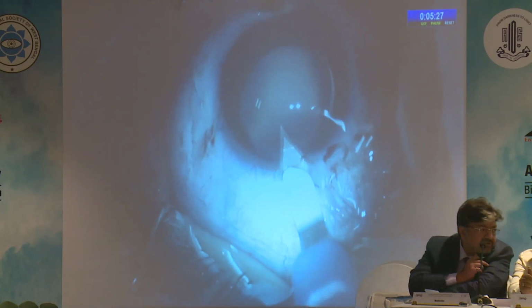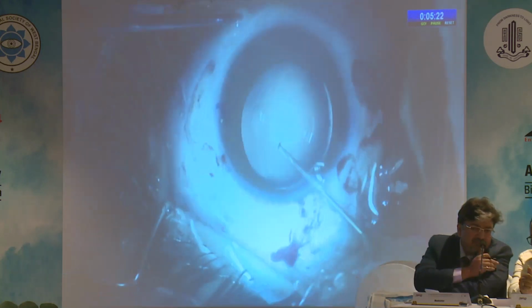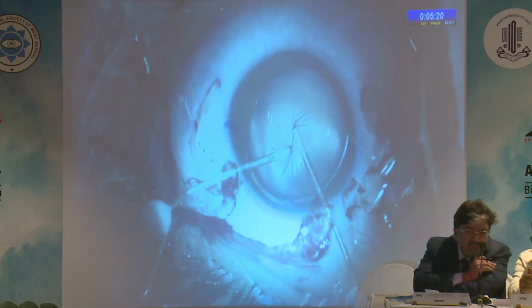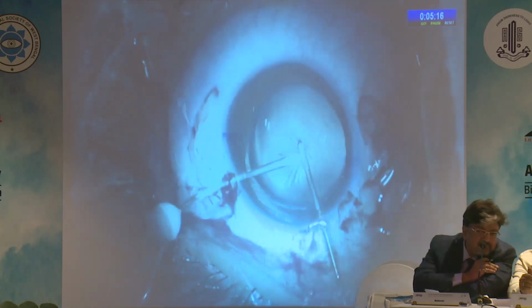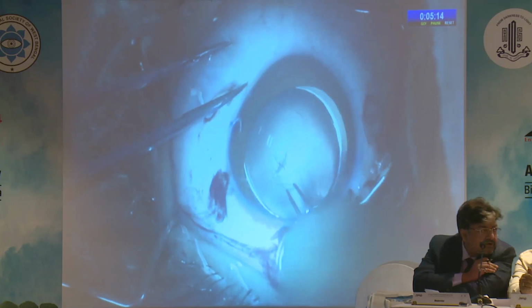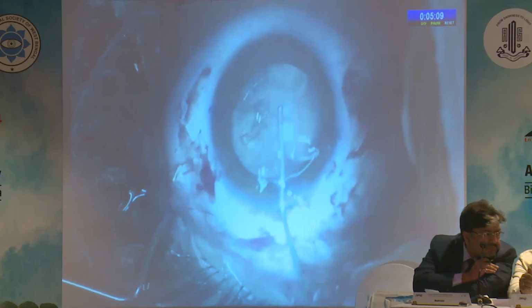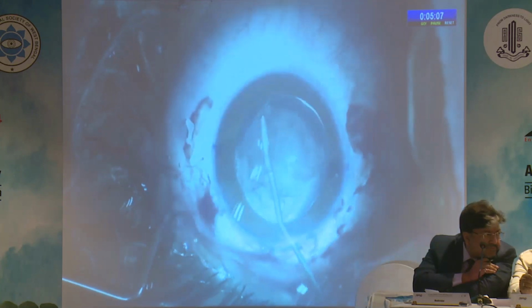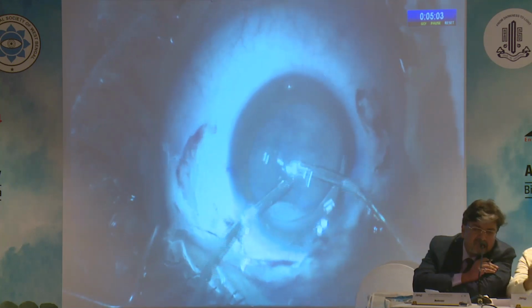We then inject some dispersive viscoelastic in the anterior chamber to flatten the capsule to start the capsulorhexis. So the crossed swords capsule pinch technique is used, which capitalizes on opposing forces from two needles directed towards each other with a pinch of the capsule between the tips. This allows a controlled and facile puncture of the capsule without creating stress on the zonules or the lens.